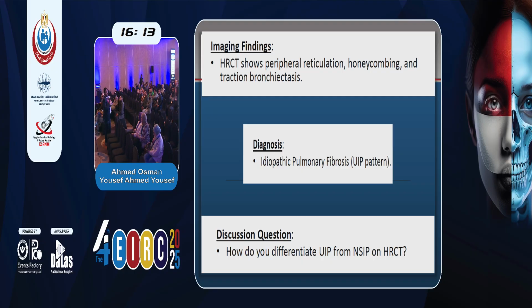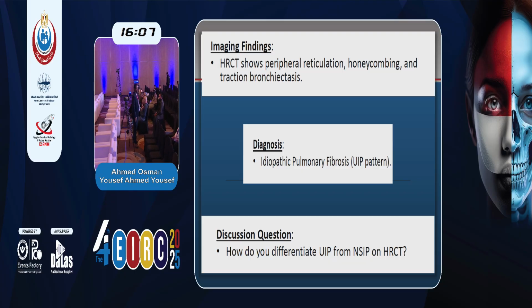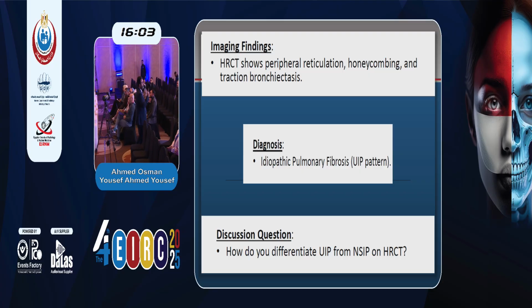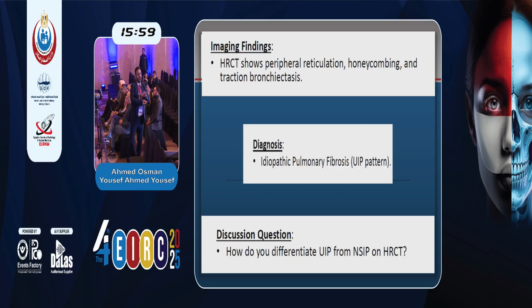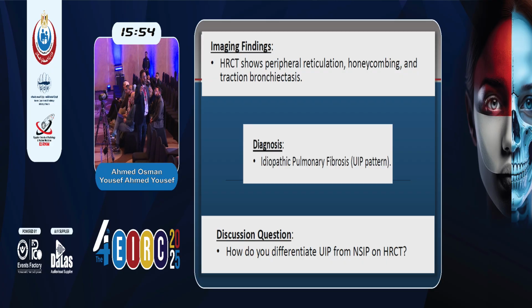No. Any interstitial lung disease, hypersensitivity pneumonitis, non-specific interstitial pneumonia, UIP, at the end stage ends by extensive widespread pulmonary fibrosis and honeycombing. That's why you must answer for the chest clinician.